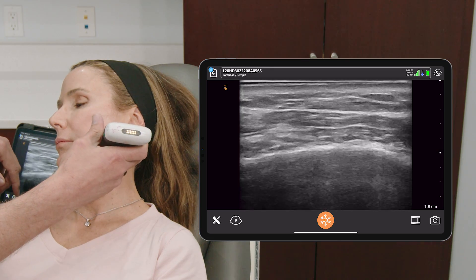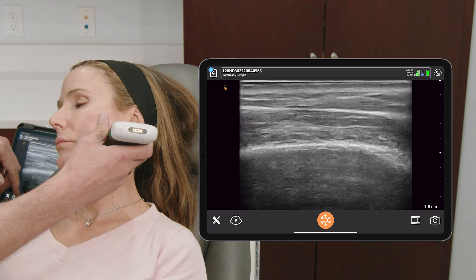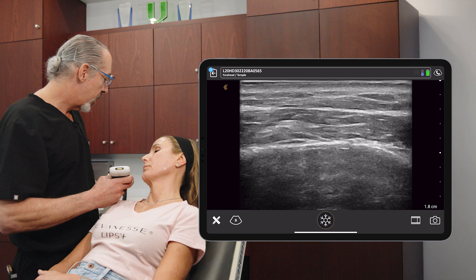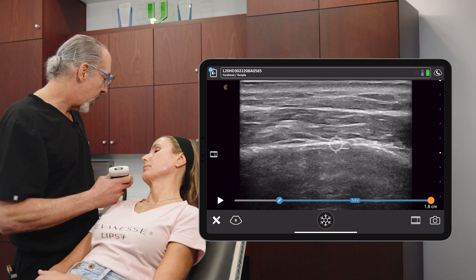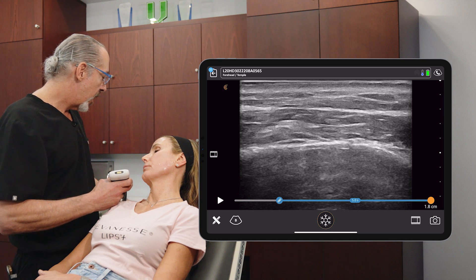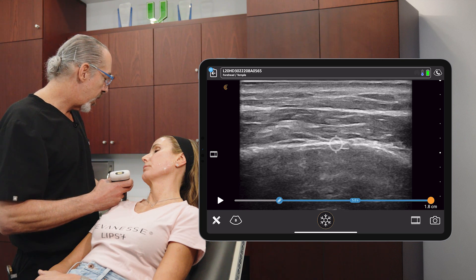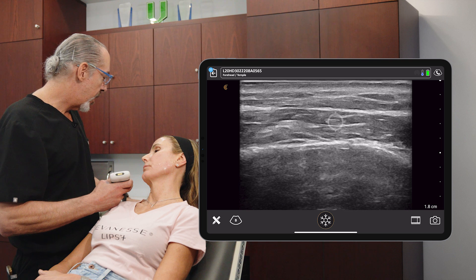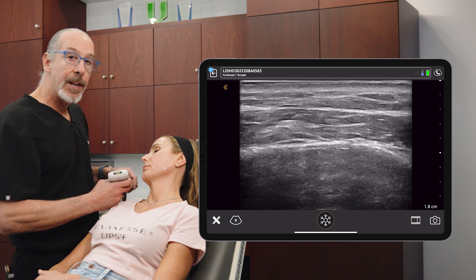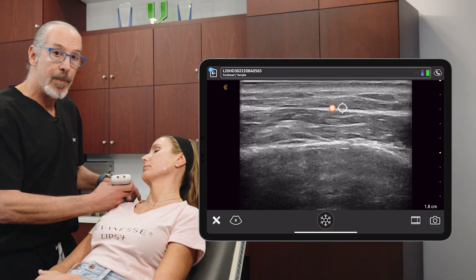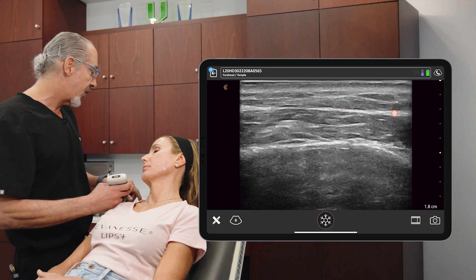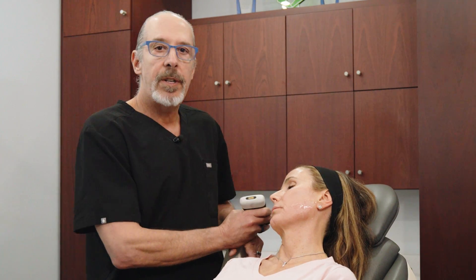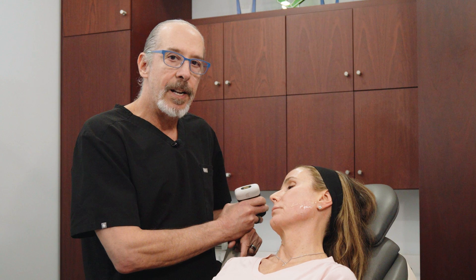Just finishing up on the mandible here — here's the bone, hyperechoic. And over here is the masseter. This is the fascia that overlies the masseter, which is the parotidomasseteric fascia. So that concludes the evaluation of the posterior jawline and the parotid area.